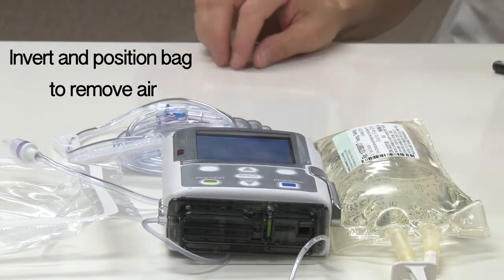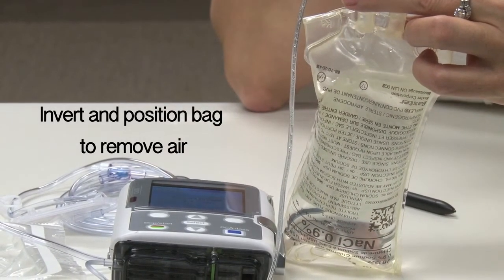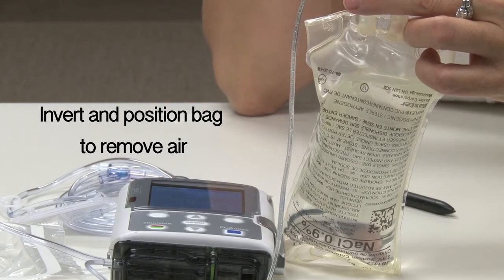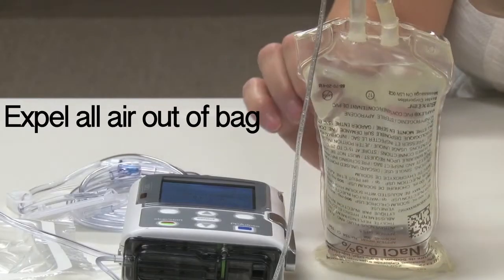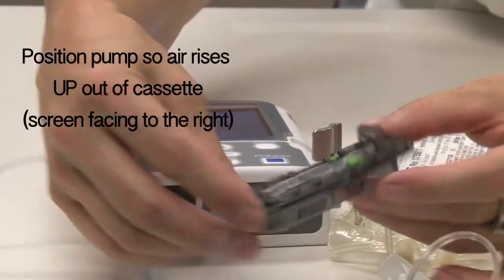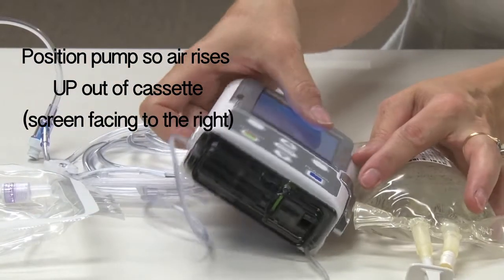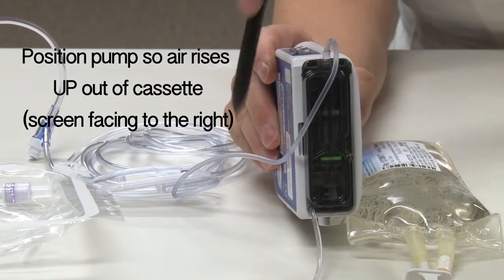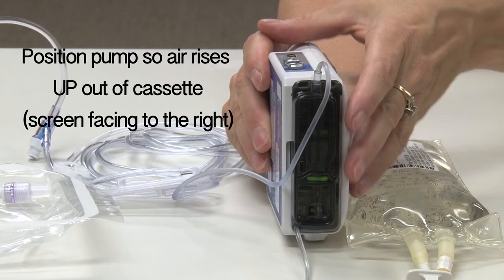Therefore, you can invert or turn the bag upside down while priming to expel the air out of the bag at the beginning of priming. This will position the air at the bag outlet port so that the air is eliminated from the IV bag. Squeeze or flick any trapped air out of the ports or corners of the bag. Air sometimes gets trapped in the cassette portion of the tubing. Some patients have recommended turning the pump to face the right so that the cassette is positioned vertically, with the filter end of the tubing coming up out of the top of the pump.